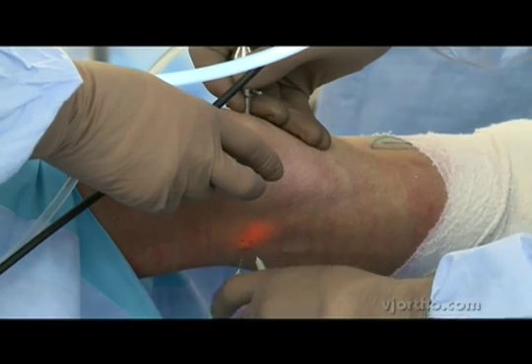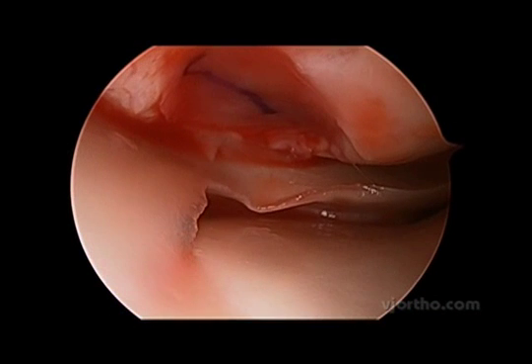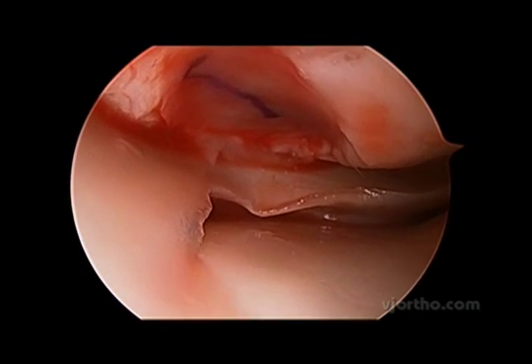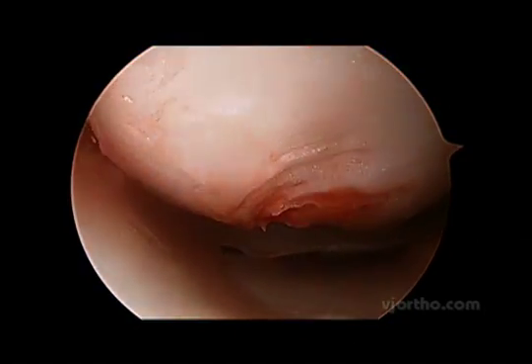We're placing the fibrin glue in percutaneously — there is the graft at the base of the lesion. We don't instill any local anaesthetic into the knee, which might be harmful to the cells, nor do we use any drainage.